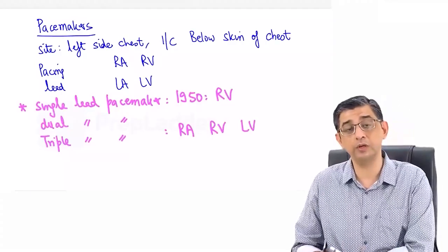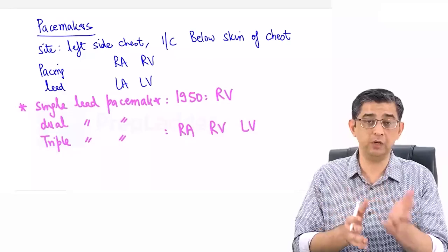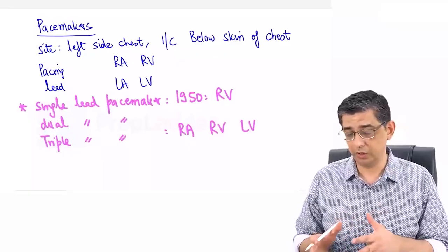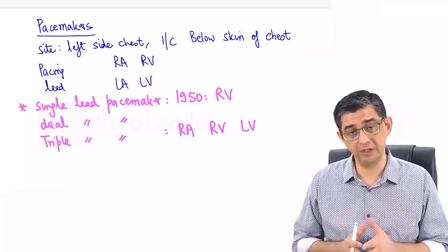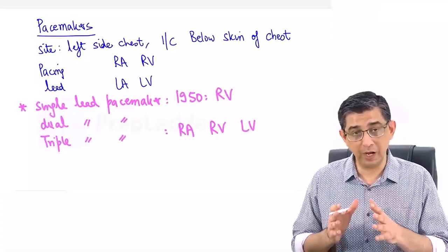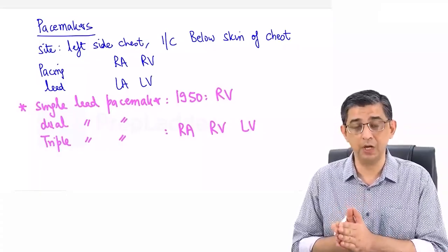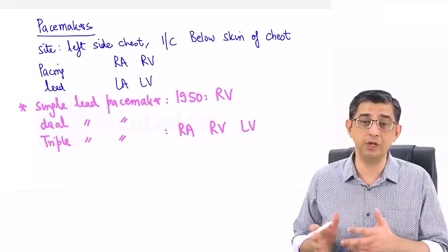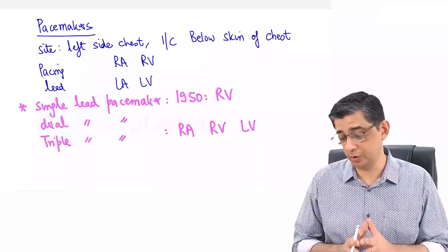On this, the query of most doctors is, well, why are you not trying to control the left atria? One, I want to say that if oxygenated blood comes in, the left atria will automatically be able to do its job. And second, the more control I try to achieve, I will obviously consume more battery. It will require more sophisticated circuit as well. In a nutshell, the technology has been apt to ensure a proper firing of all these chambers at the right time. We are able to ensure proper blood goes to lungs for oxygenation, and once we time the left ventricular contraction or ejection, systemic circuit and cardiac output will definitely be obtained.